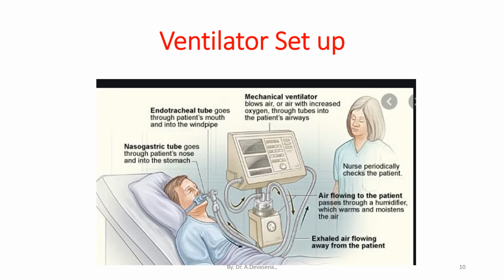Nasogastric tube goes through the patient's nose and into the stomach. The exhaled air flows away from the patient. The nurse periodically checks the patient. This is represented here.